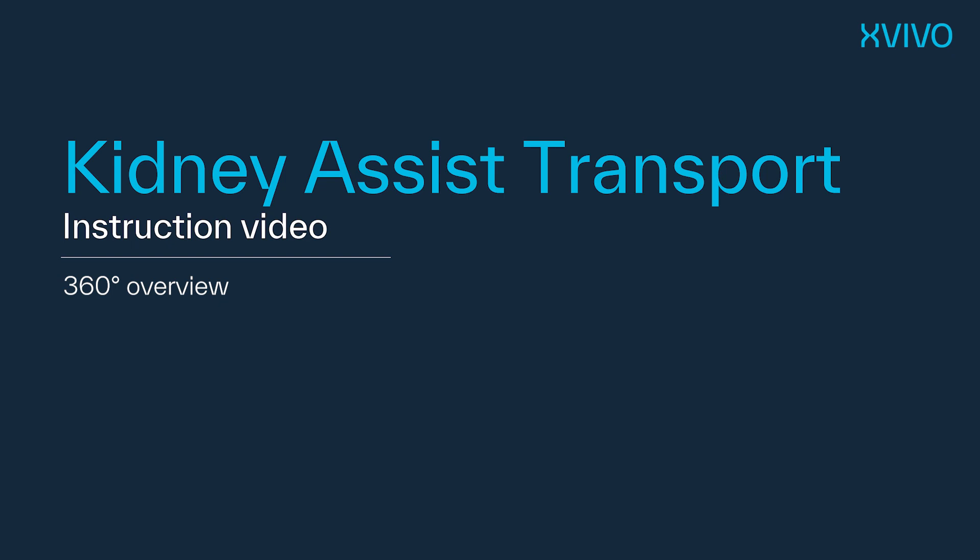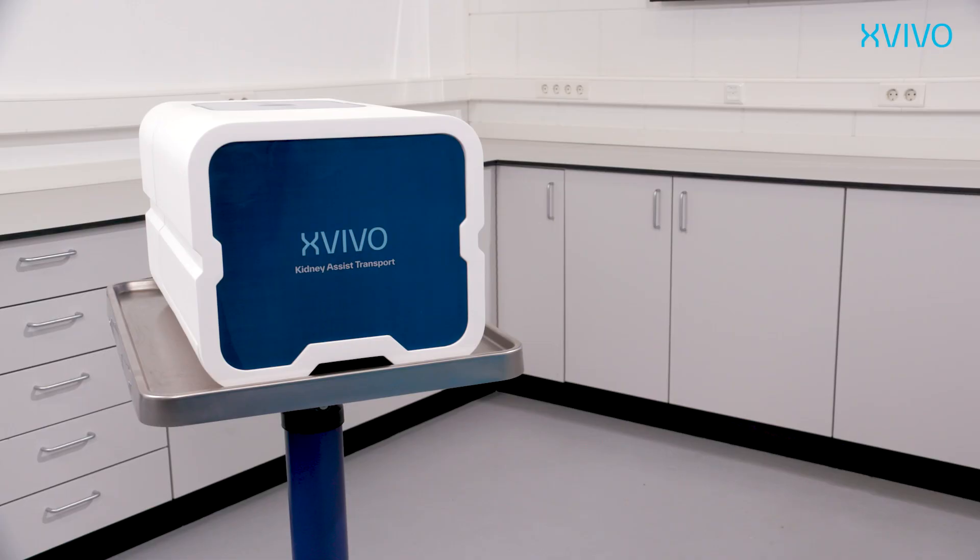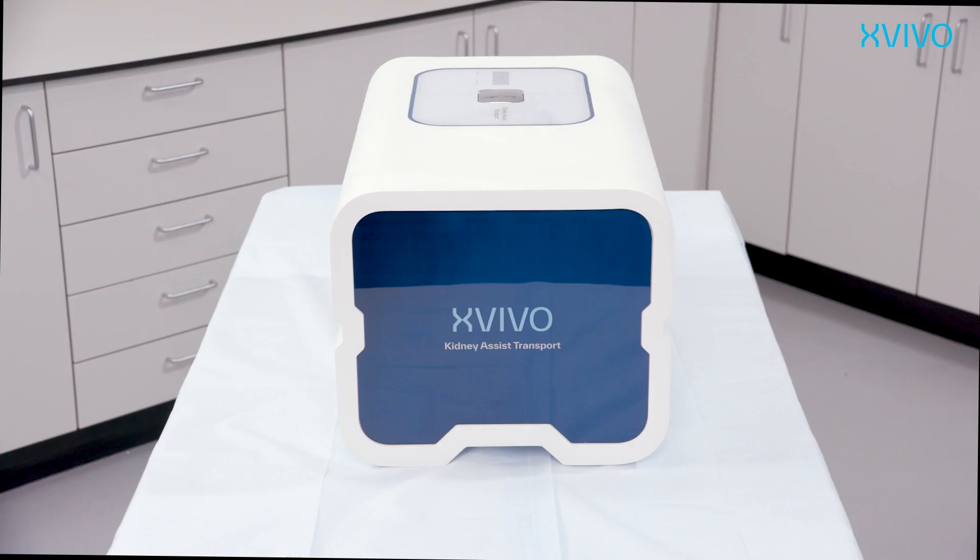Welcome to the instruction video of Xvivo's Kidney Assist Transport, a transportable system for hypothermic oxygenated machine perfusion of kidneys.